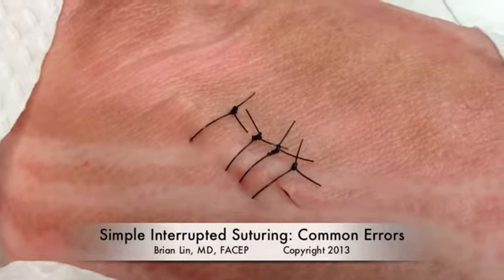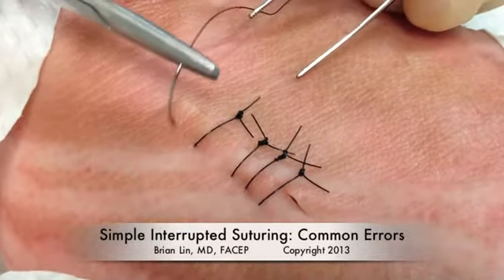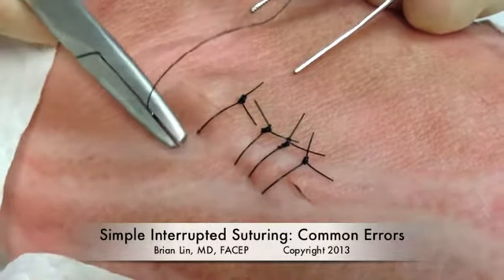The purpose of this video is to show some of the common errors I see residents making when they're beginning to learn their simple interrupted suturing techniques.